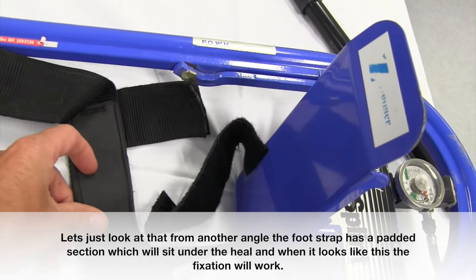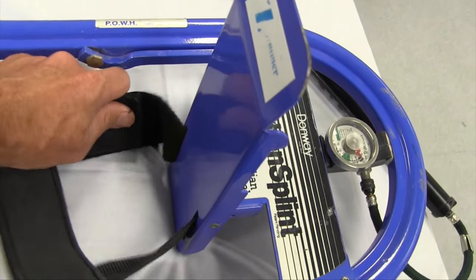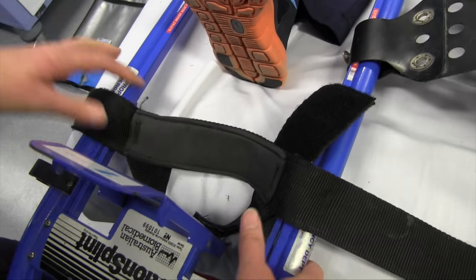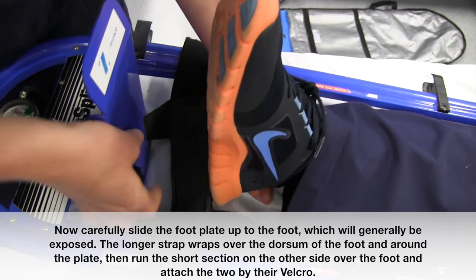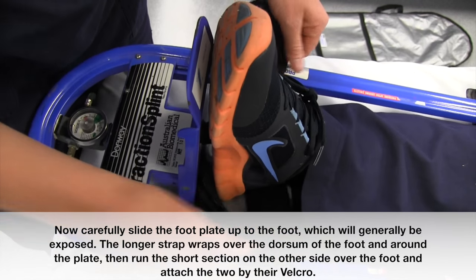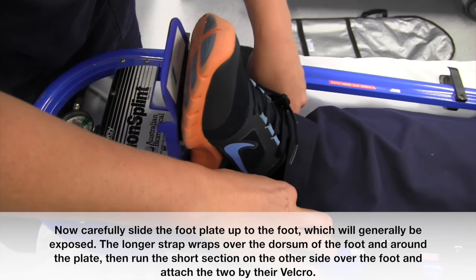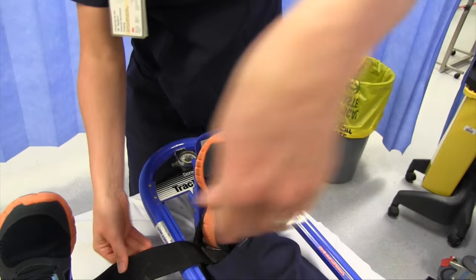Let's look at that from another angle. The foot strap has a padded section which will sit under the heel, and when it looks like this, the fixation will work. Carefully slide the footplate up to the foot, which will generally be exposed. The longer strap wraps over the dorsum of the foot and around the plate, then run the short section on the other side over the foot, and attach the two by their velcro.